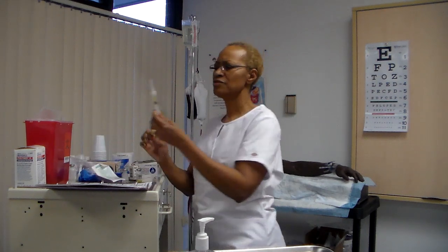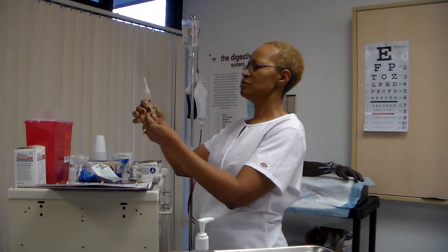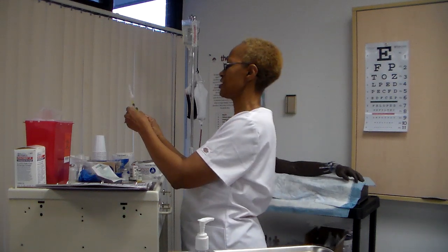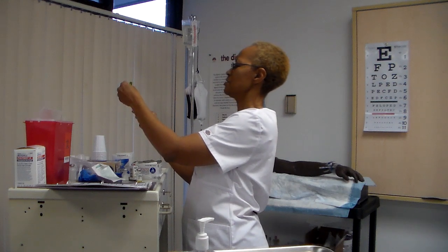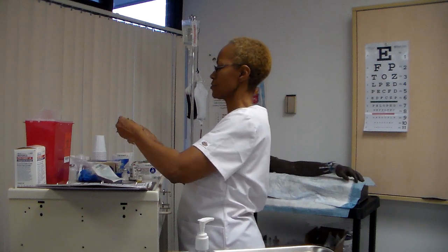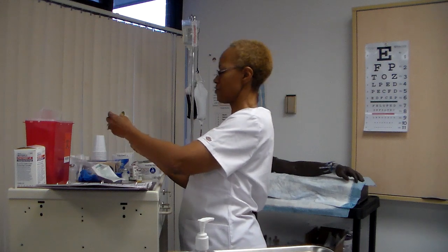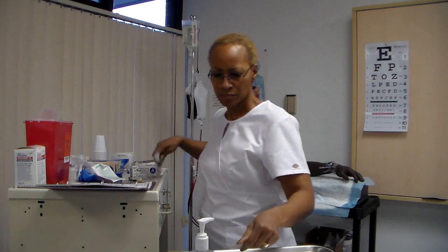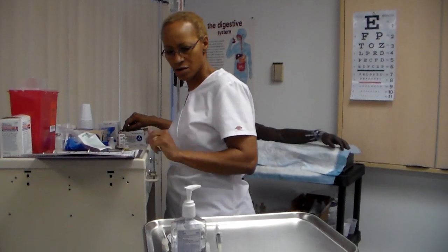Draw my medication up that I'm going to be administering. This is interesting. I don't know if you can see this, but this is a needle protector that just slides up over the needle. You'll see when I get ready, after I give the injection. Okay, make sure I have the right amount. I'm going to take in my medication. Alcohol.